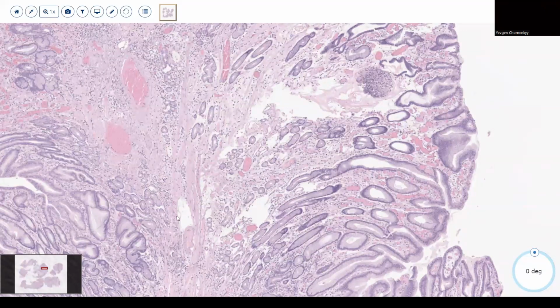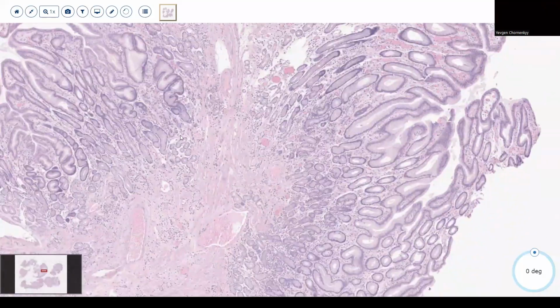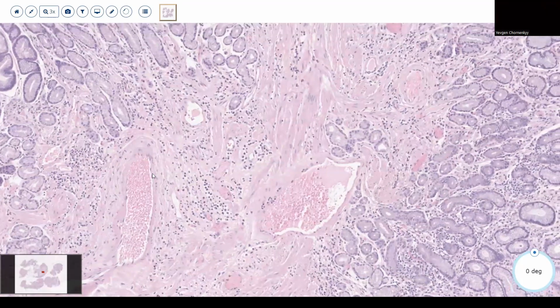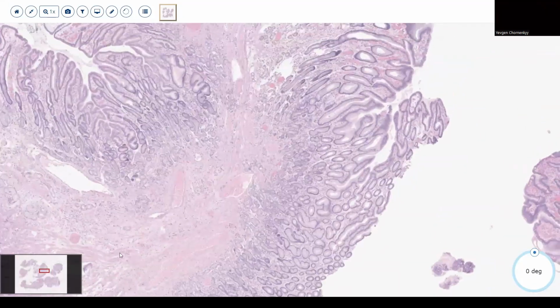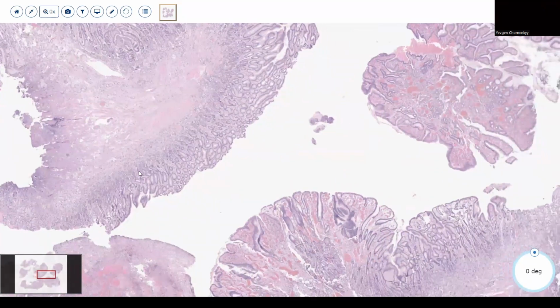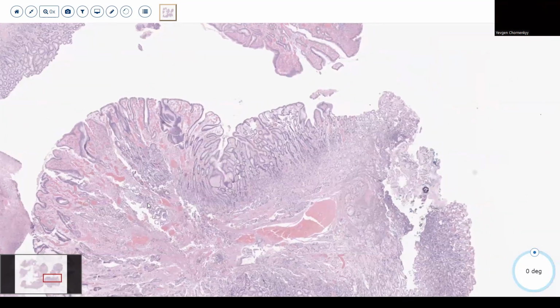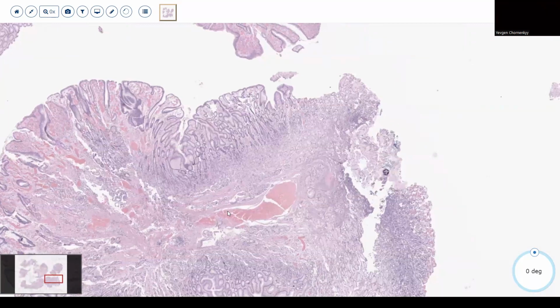Apparently, I don't know if that's true, but the books say it's true, so it must be true. So the take-home picture here is really large dilated vasculature. And a patient has portal hypertension and cirrhosis, so you're thinking about one of two things: portal hypertensive gastropathy, or gastric antral vascular ectasia.